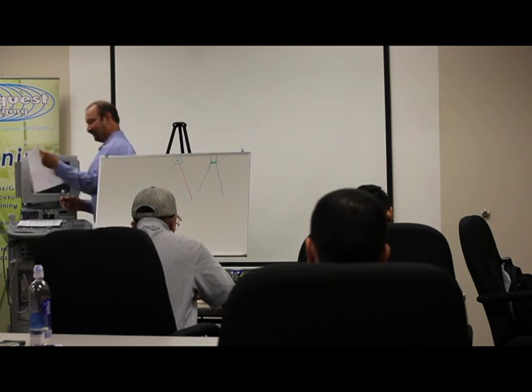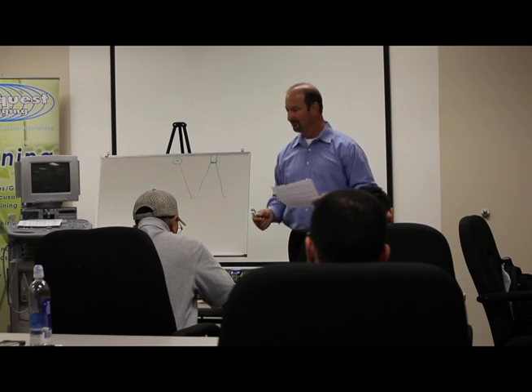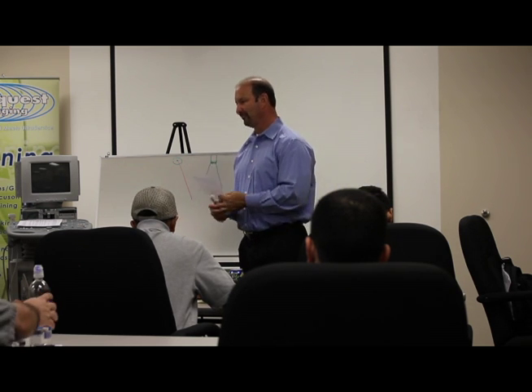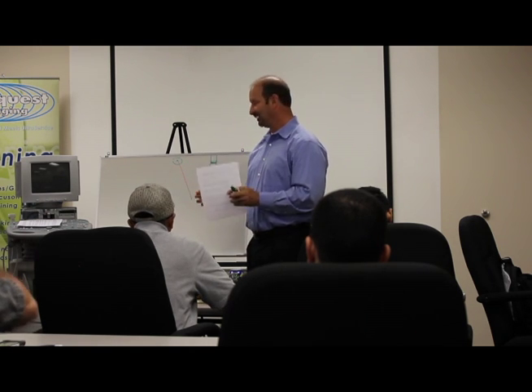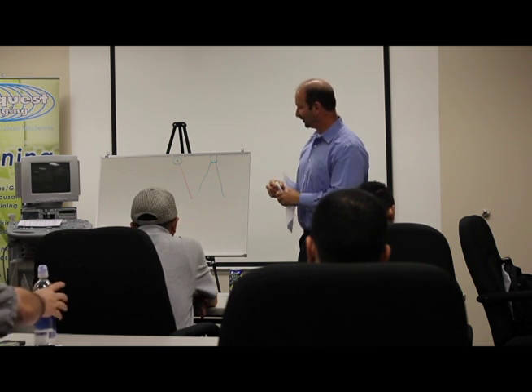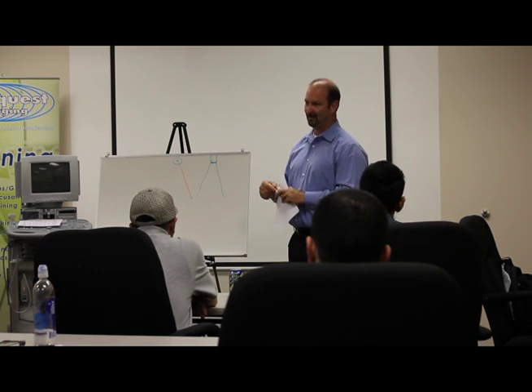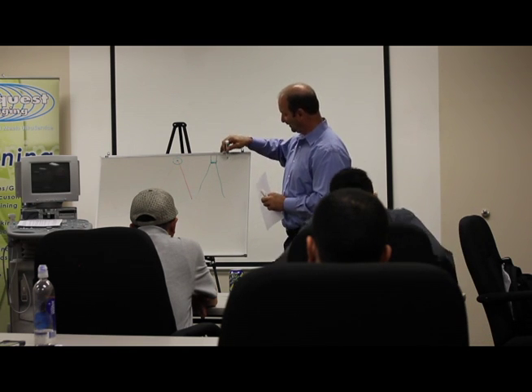Any questions so far? On the transducer, I assume the crystals are at a slight angle, or am I all the way off? Good. A slight angle, exactly. And then you can also do beam steering out of these angles, or out of each crystal.